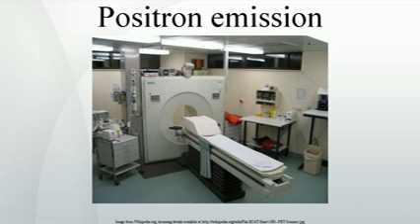Image reconstruction. The raw data collected by a PET scanner are a list of coincidence events representing near simultaneous detection, typically, within a window of 6 to 12 nanoseconds of each other, of annihilation photons by a pair of detectors. Each coincidence event represents a line in space connecting the two detectors along which the positron emission occurred, that is, the line of response, LOR.